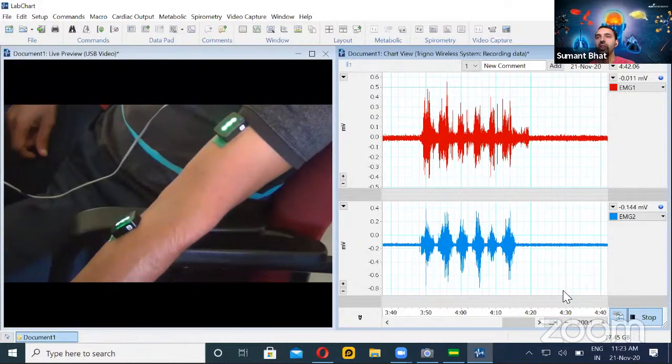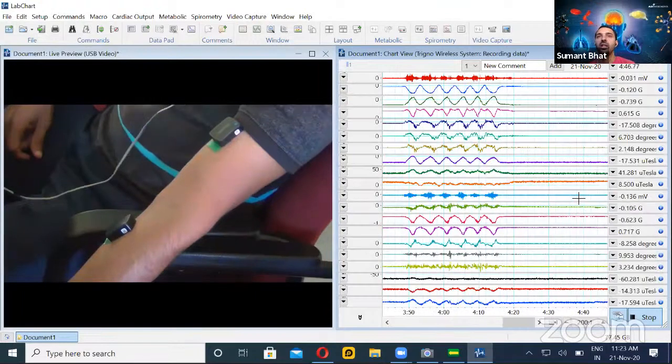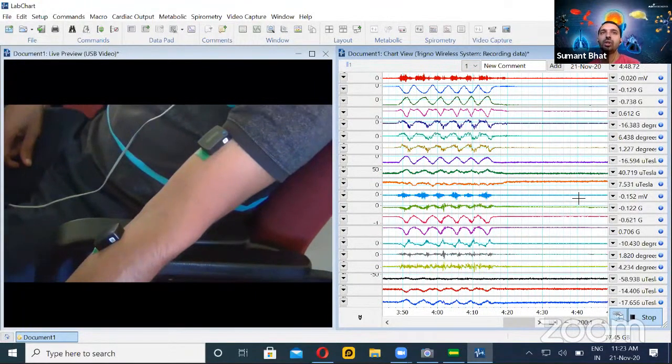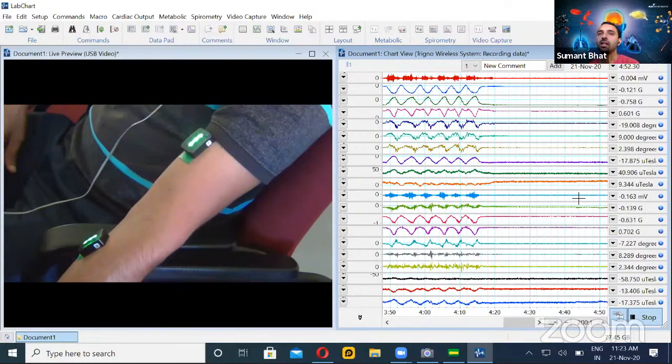We can also see other parameters — not just the EMG. With each sensor, you can have roughly about 10 signals.